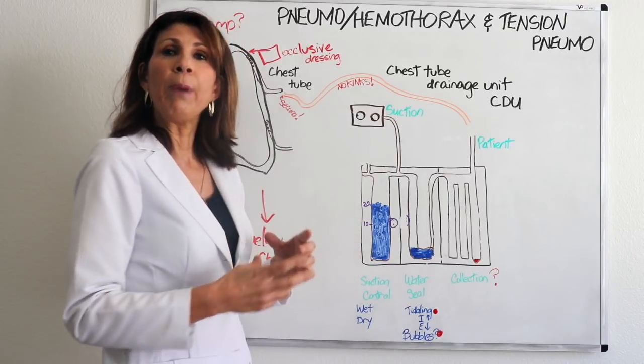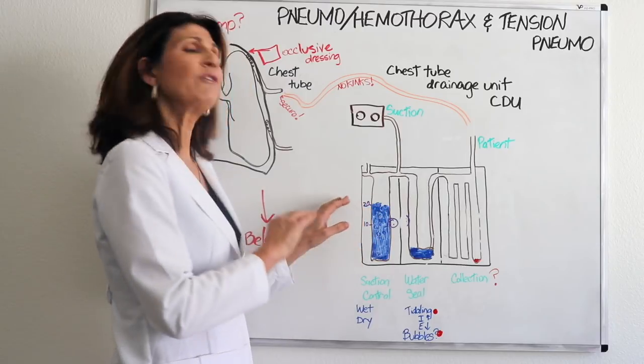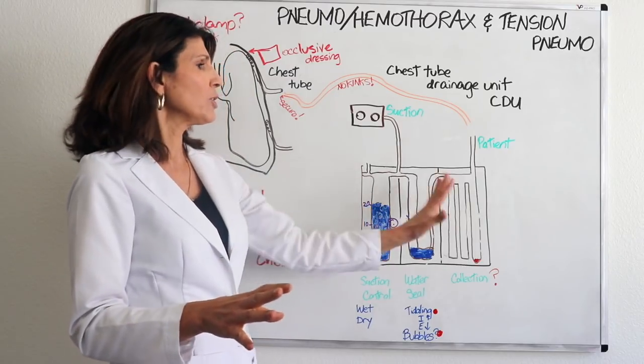Now, when water bubbles, it does tend to evaporate. So that's another thing you need to keep in mind: after you fill it up, you're not done for the duration of the chest tube.